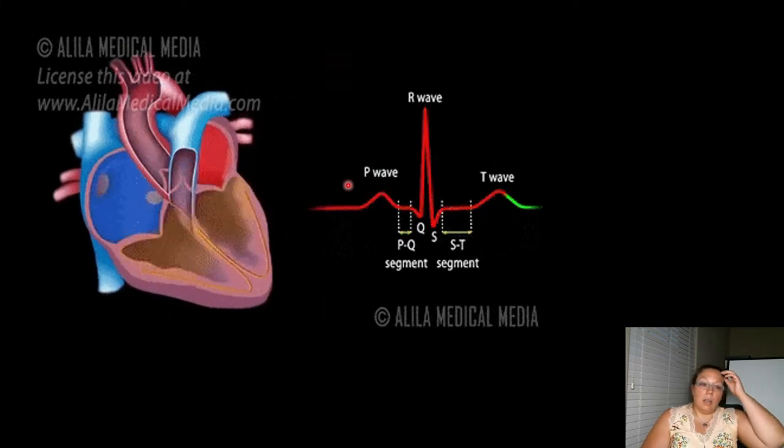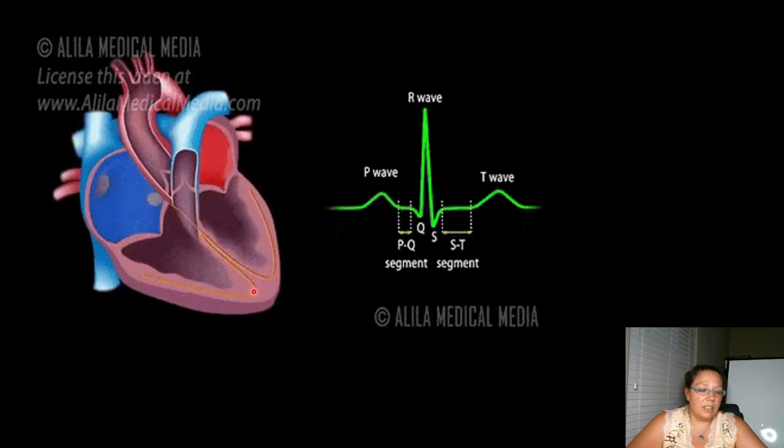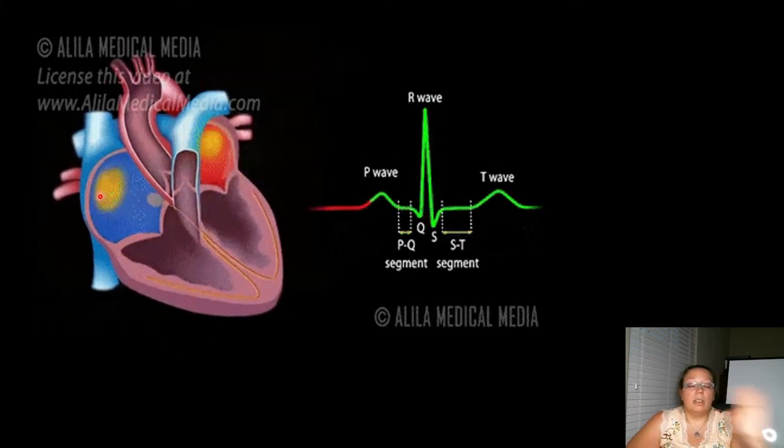Okay. So here's another way we can see it. We're going to go through this a little bit so you can kind of visualize what the heart's doing during the electrical activity. Your P wave is going to travel down, stops there. You can see it with the QRS, it goes to the ventricles, causes them to contract, push the blood out, and then everything resets with the T wave. Sometimes I lay awake at night visualizing this because I'm a nerd, but it's really cool. The next picture is going to be even cooler.